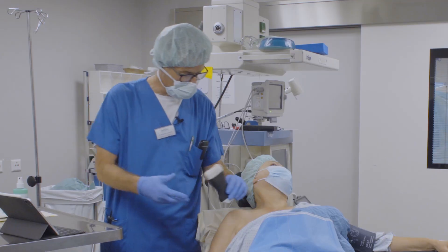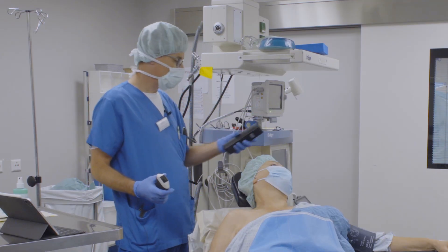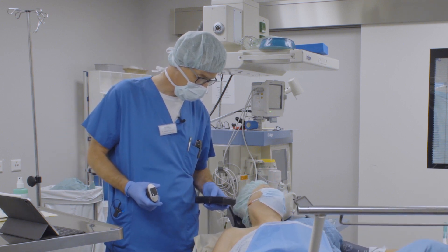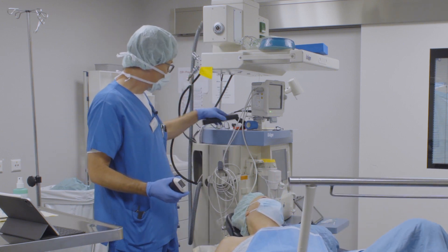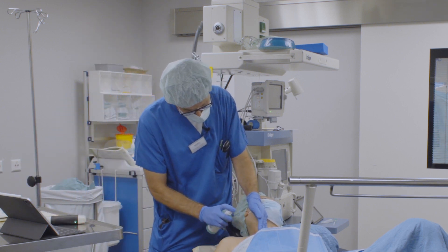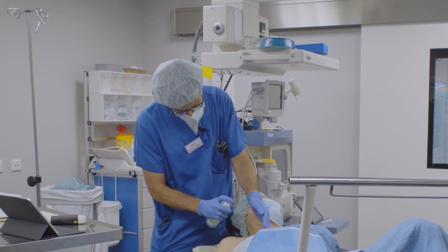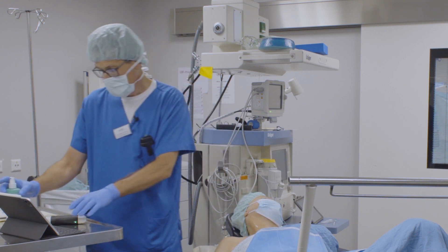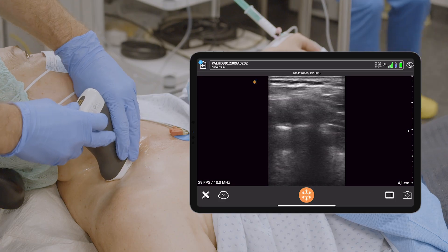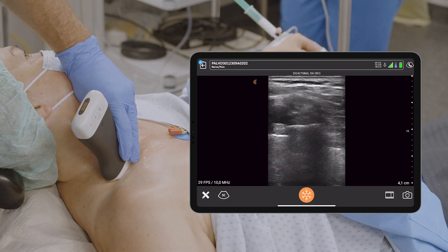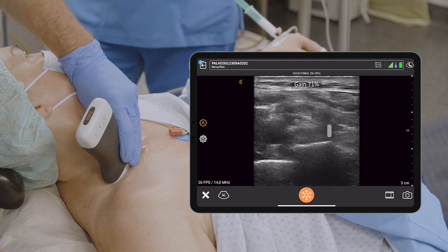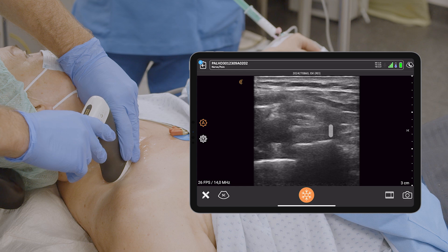I will do a quick pre-scan, then change the position of the table. The table position is beach chair already, which facilitates all the processes here in the operating theater. I put the probe on with the marker pointing to my left in order to have the correct image orientation, and quickly adjust the image on the touchscreen.